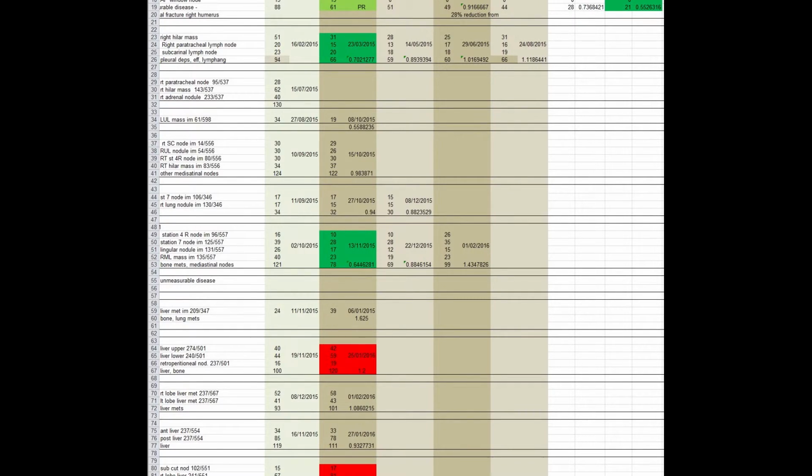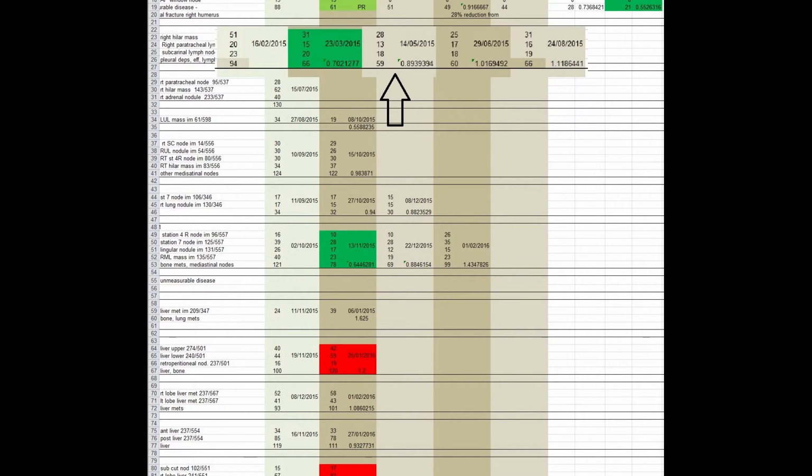This is a snapshot of data entries for a study recording individual measurements over sequential examinations. I find this form of record is essential for maintaining accuracy in RECIST reporting. The green denotes partial response, generating a new baseline for comparison. The red represents progressive disease. You can see that in this instance there has been a further reduction in measurement following a partial response, but then the measurement is increasing, generating a nadir for subsequent evaluation of percentage change in size.